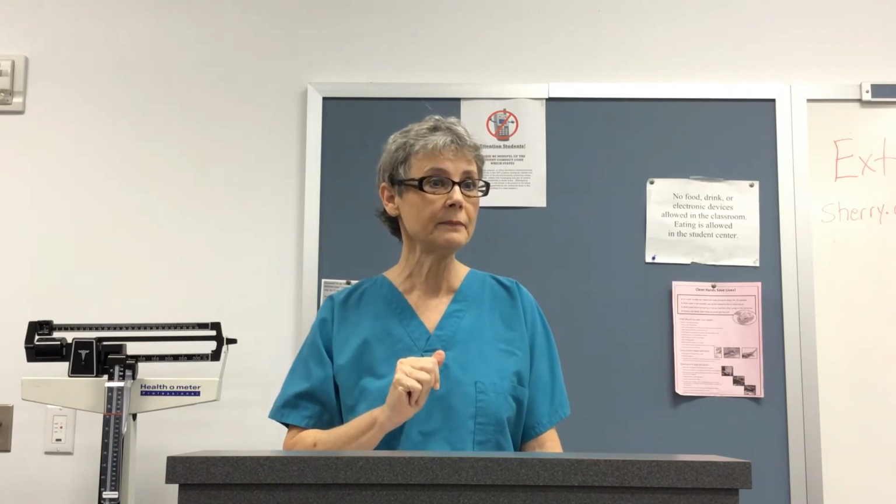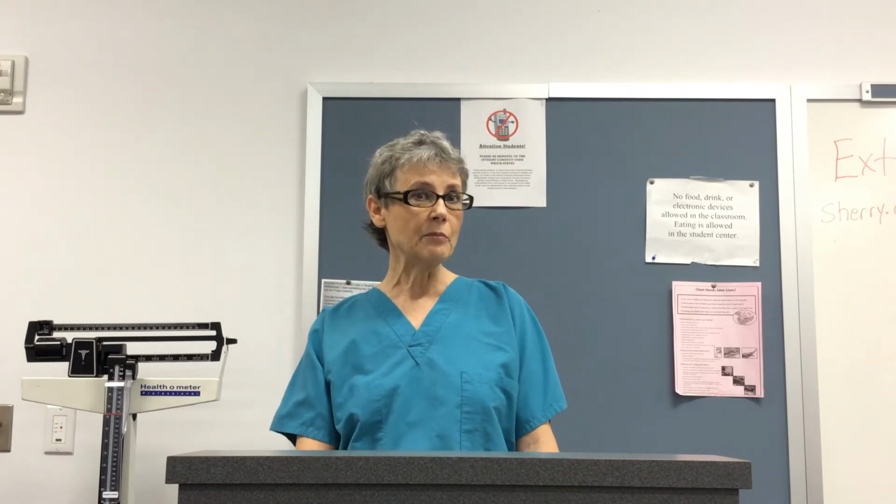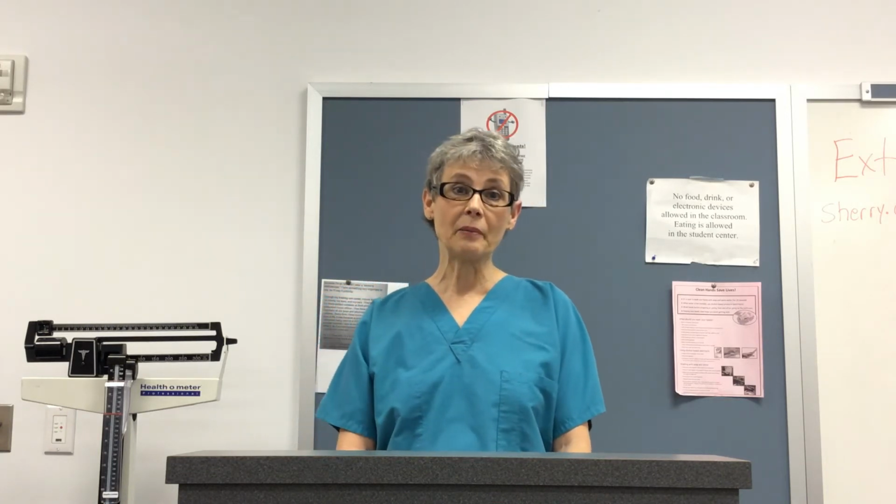Yet, oftentimes, you will hear a patient ask, nurse, I see an air bubble coming down my tube. Is that going to hurt anything? And you may hear that nurse say, oh, that's just such a little tiny bubble. That's not going to hurt anything at all. But I want you to remember that yes, any air bubble is a foreign object to your body. It does not belong in your circulation system. And you could have possible complications.